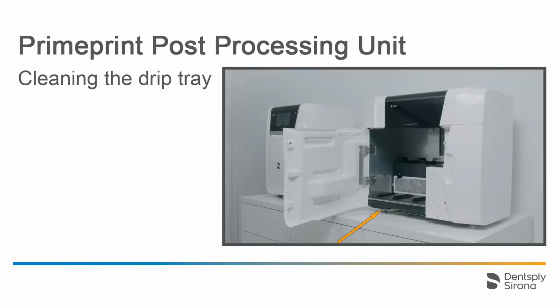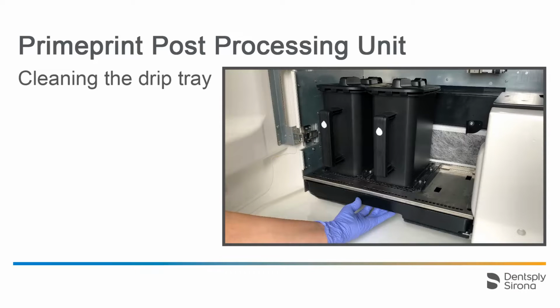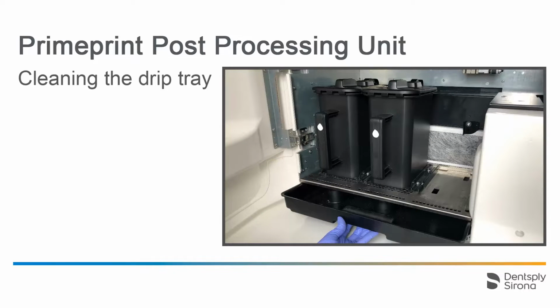Finally, we will look at the collection vat which is located under the post-processing unit. This vat has the same capacity as a cleaning container and is intended to catch isopropanol or print resin in case of a spill from one of the containers. This drip tray can be pulled out, as shown in the photo.